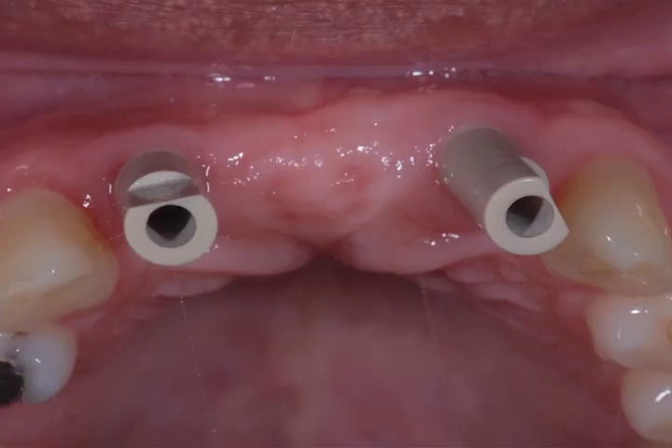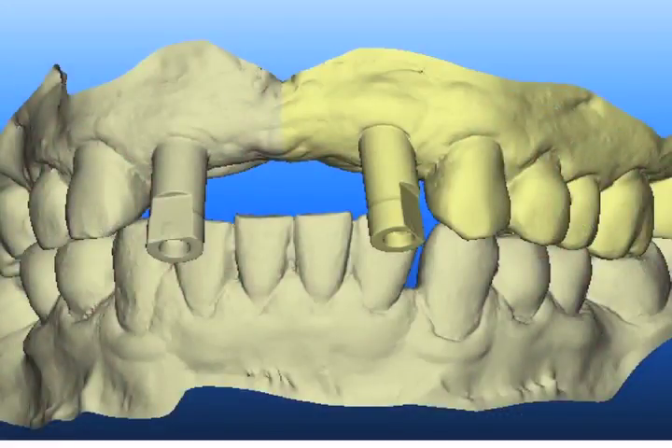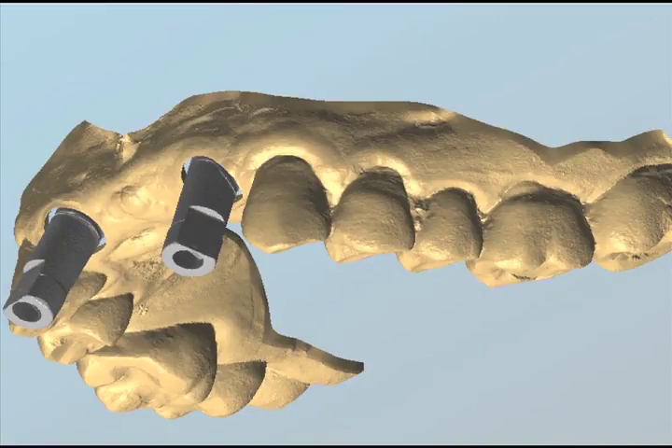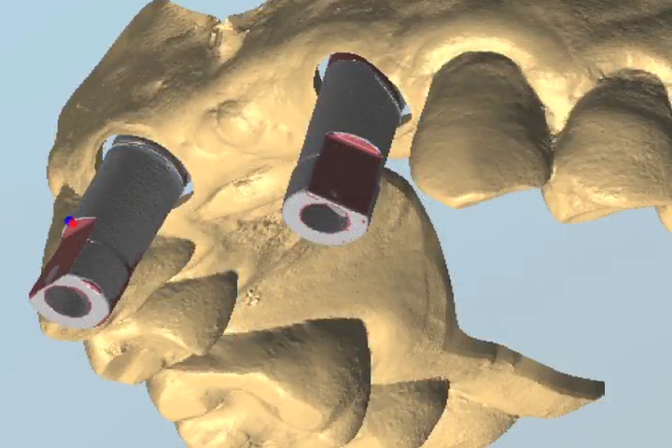Glidewell provides a library of different implant fixtures that can be used in the scanning process. Here the Glidewell regular platform abutment shows a very nice tissue contour and no bleeding — it looks good. Now I'll walk you through the virtual images and steps used to create our all-zirconium abutment. This is the first image that Cadent will see. Once the scatter information is removed from the image, it is sent to Glidewell, and this is the picture that Glidewell sees in their virtual representation. You can see clearly the detail of the scannable abutments, including a close-up of the edges and the keyway of the scannable abutment.